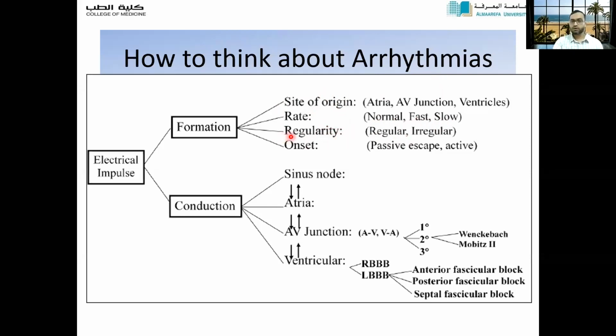And as I told you before, it can be a defect of regularity. You have to look into whether it's regular or irregular, or the onset of the arrhythmia, how it is there, whether it's just a passive arrhythmia where the SA node is not working and some other beat has taken place, or it's an active focus which is firing abnormal impulses.